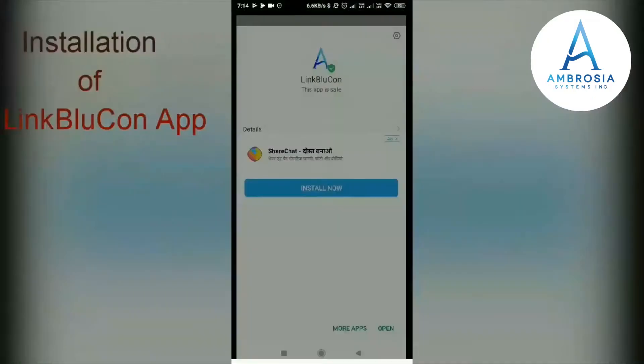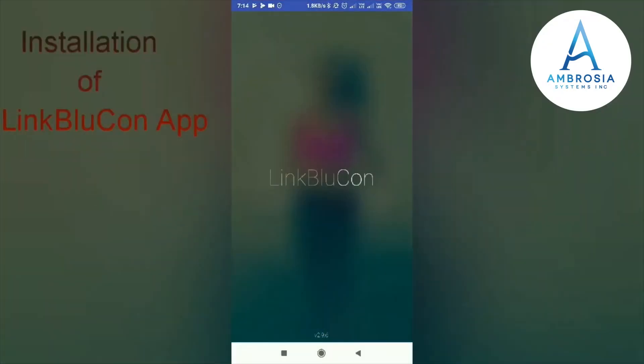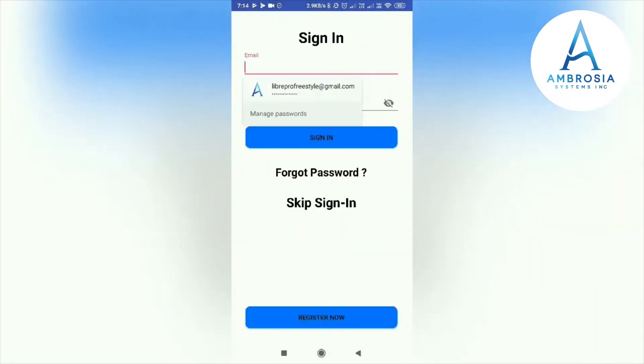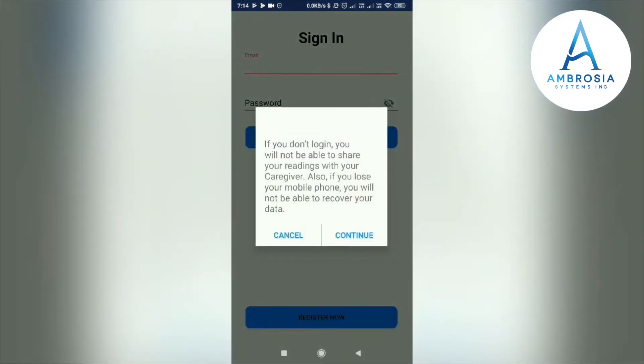The app is asking for required permissions. This is the sign-in window. You can skip the sign-in, but if you do not log in, you will not be able to share your readings with your caregiver. Also, if you lose your phone, you will not be able to recover your data.